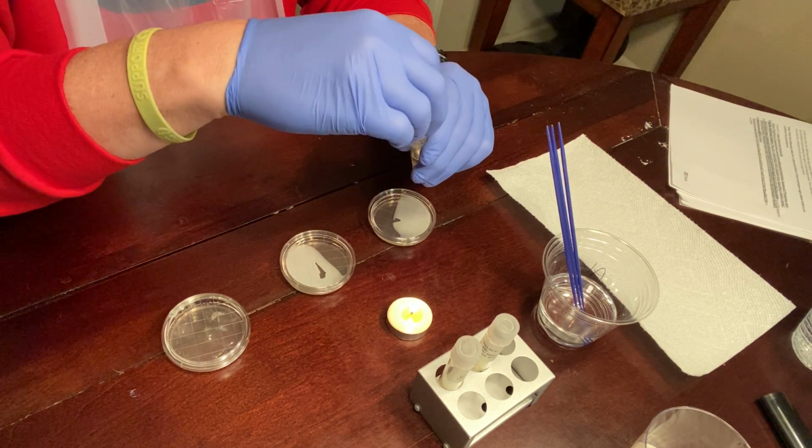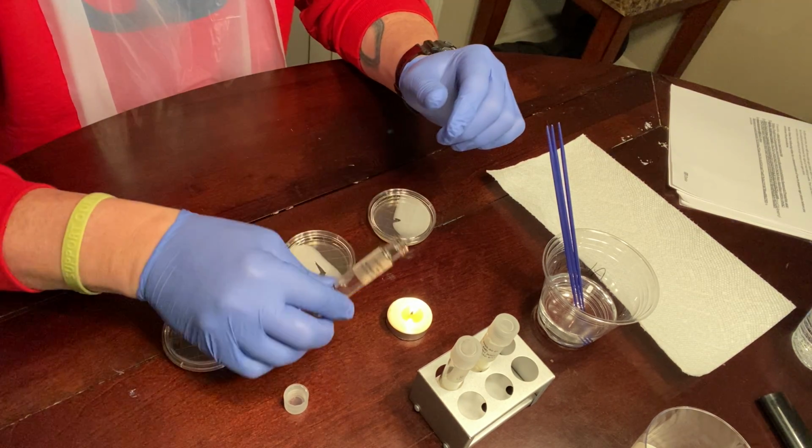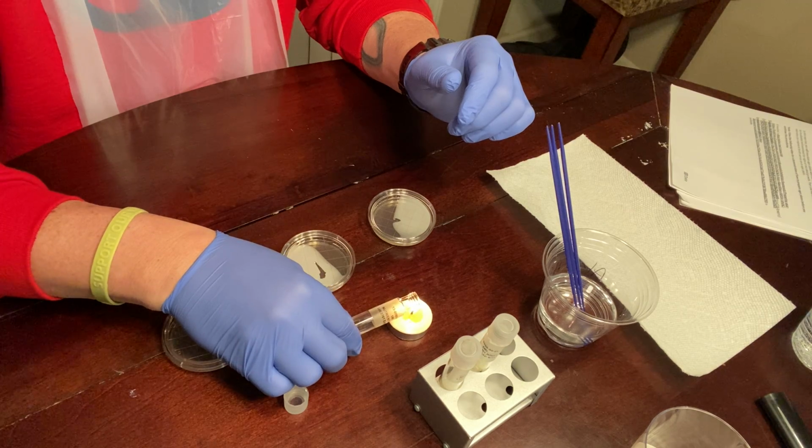So I'm going to remove the cap. Sterilize the lip here.